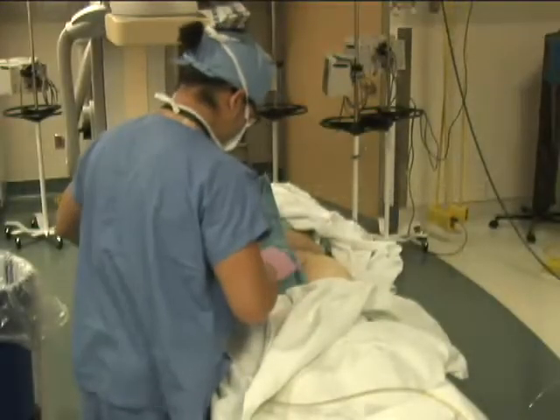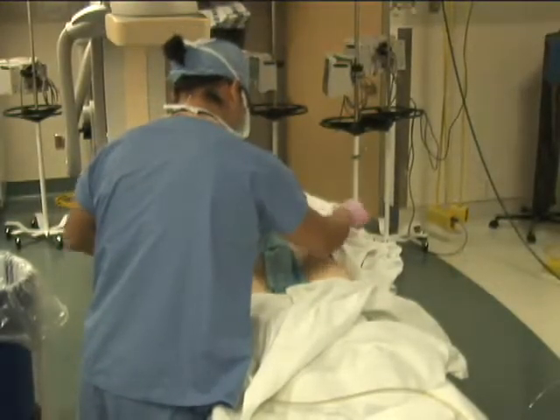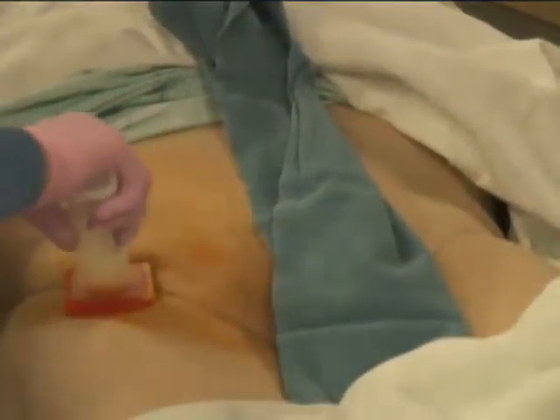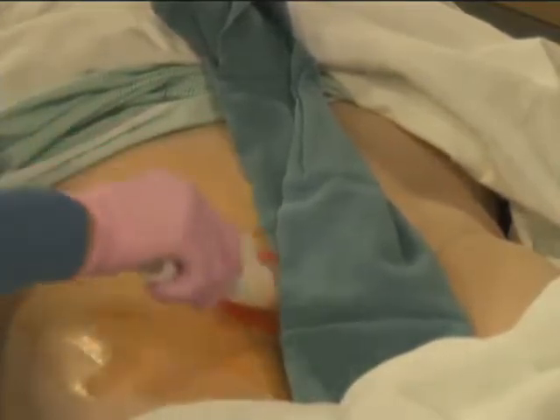The patient is placed supine on the catheterization table with both groins exposed. Hair is removed with a razor, and the areas are scrubbed and cleaned with a sterile soap solution.